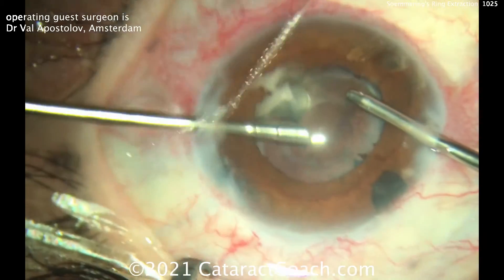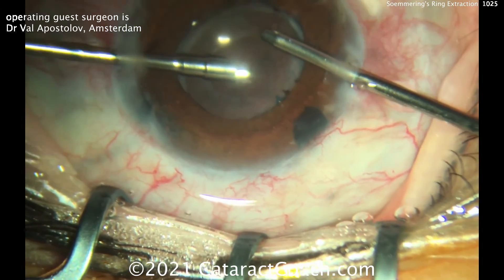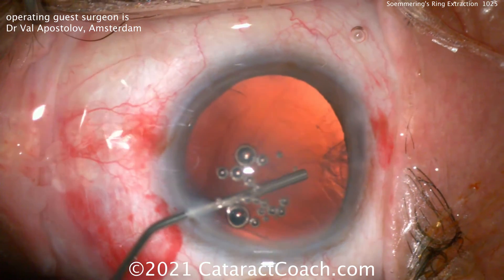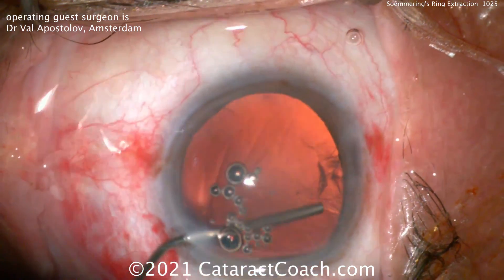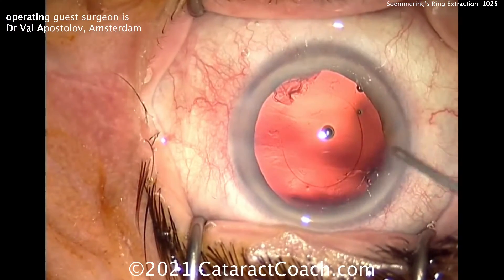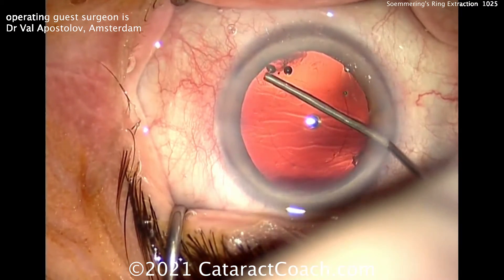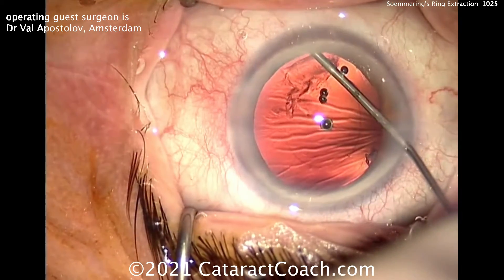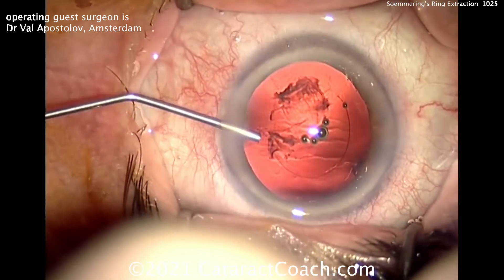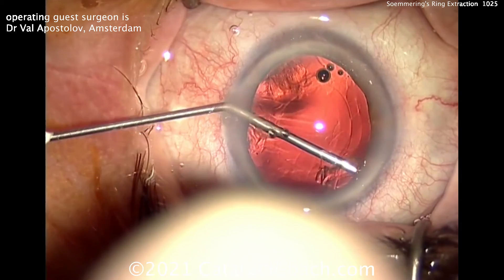Now for the bonus: wait till you see this — another trick from Dr. Apostolov on how to get out that last bit of cortex. At the end of the case, before you fill the capsular bag with viscoelastic, aim the viscoelastic over at that last piece and inject right into the capsular bag equator. You can use that viscoelastic to push that piece of cortex right out. You can then remove it at this point, or go ahead and insert the IOL after filling up the capsular bag and remove it all at the end because it's all been freed up.